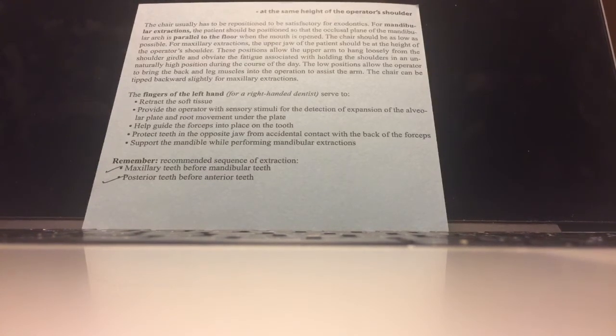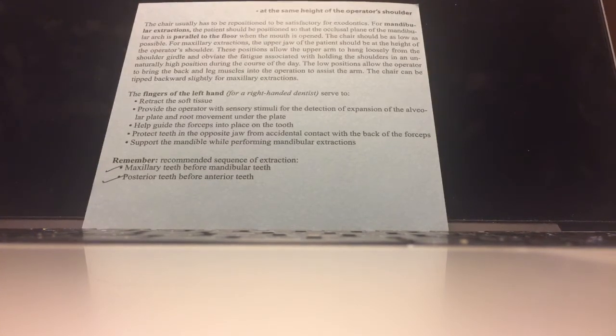The chair can be tipped backward slightly for maxillary extractions.